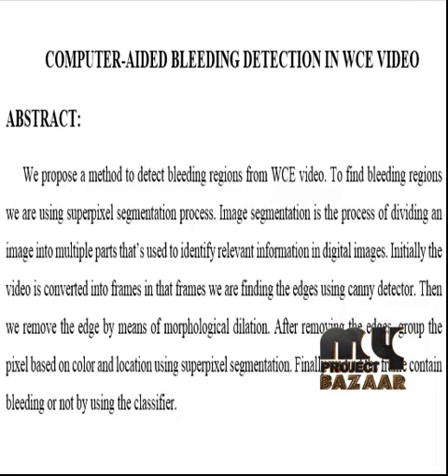The dilation operation uses a structuring element for probing and expanding the shapes contained in the input images. The image is dilated, and the coordinate points known as the structuring element are employed for the dilation process. The dilation of the images produces a binary image in which all the locations of the structuring element are combined, and if it hits the particular 0 positions, then it replaces all the pixel coordinates.